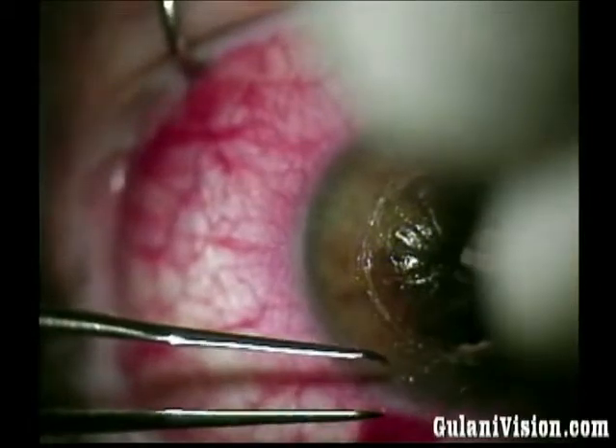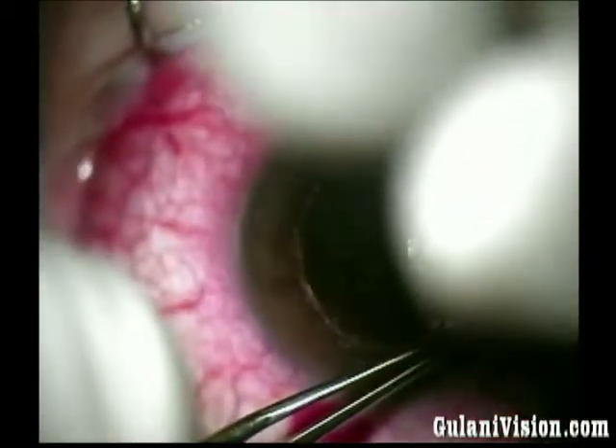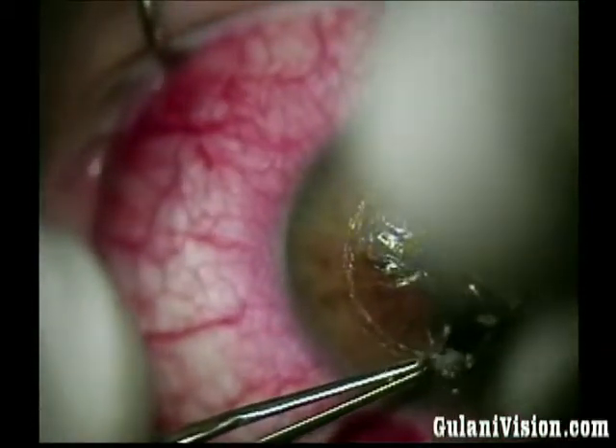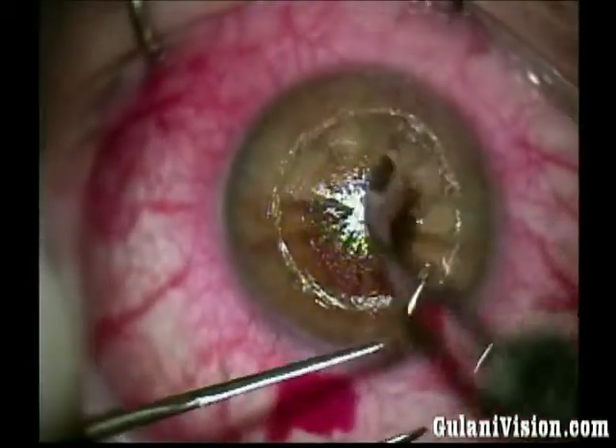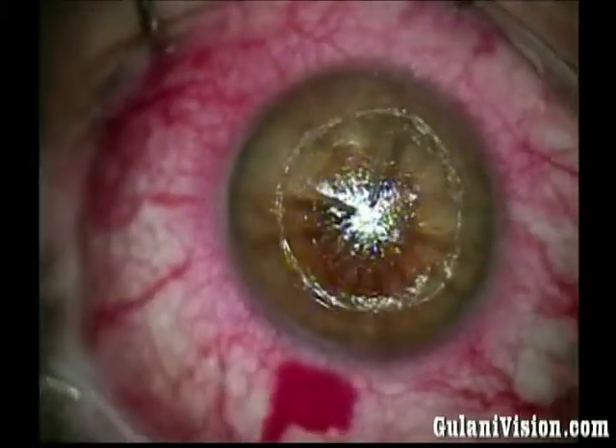At each stage you see me holding or providing resistance with my forceps. In this way I am transferring the resistance between instruments and not onto the cornea. Now I remove the excess sliver.